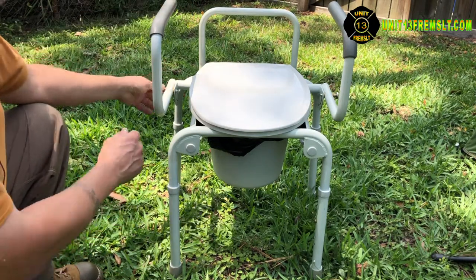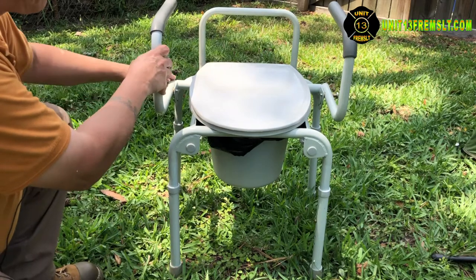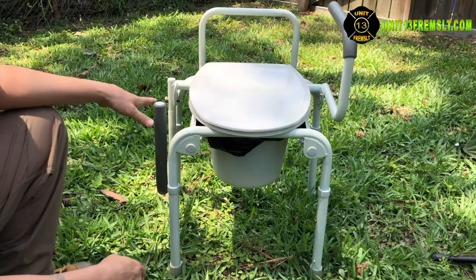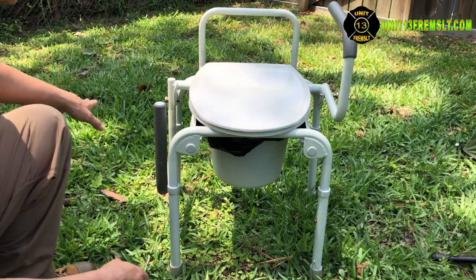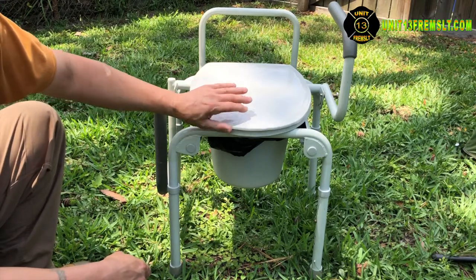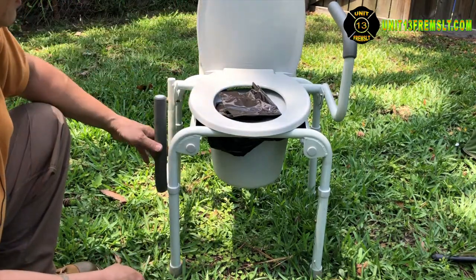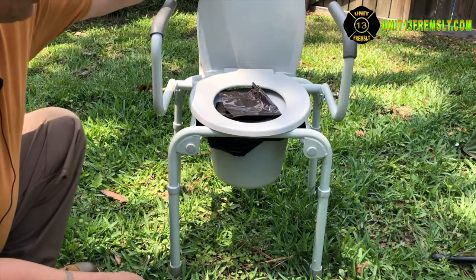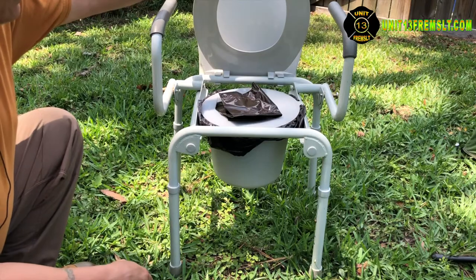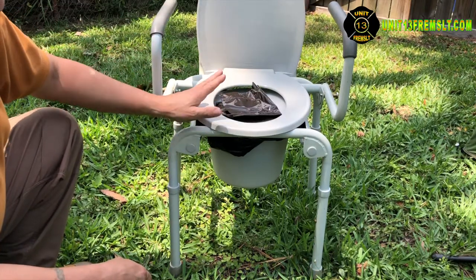This particular model has drop-down arms, so if somebody needs to get onto this from a wheelchair, they can come in from the side and slide right across and get on. It's got a lid like your normal toilet as well.